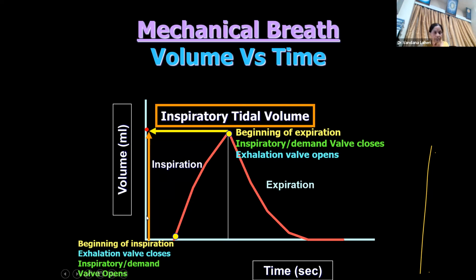Now, this will tell you the amount of tidal volume on the graphic. This is your tidal volume. This is your inspiratory time. This is your total expiratory time. Out of this, active expiration is this much. And this is your expiratory pause time, which you can see on a volume graphic. How much is the pause time?